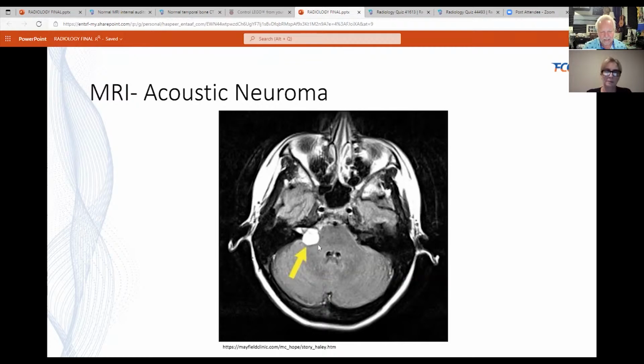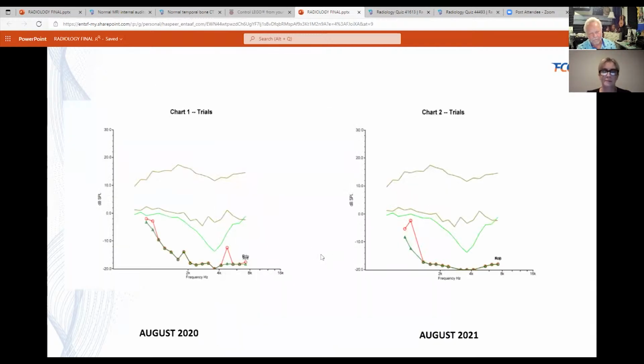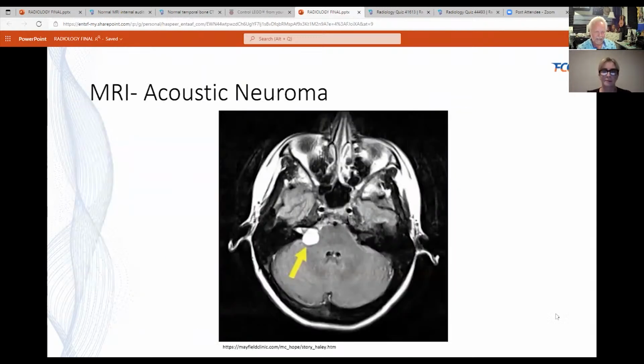And then you have this unmistakable acoustic neuroma, which is starting to push into the brainstem a little bit. So that explains the rapidly dropping word discrimination. This is a large acoustic, and it's causing compression on the nerves, on the blood supply. It extends deep into the internal auditory canal. Sometimes you'll see them actually growing in the cochlea itself. And I don't think I can scroll through this one, no. So anyway, that is what you need to be worried about with asymmetric hearing loss.